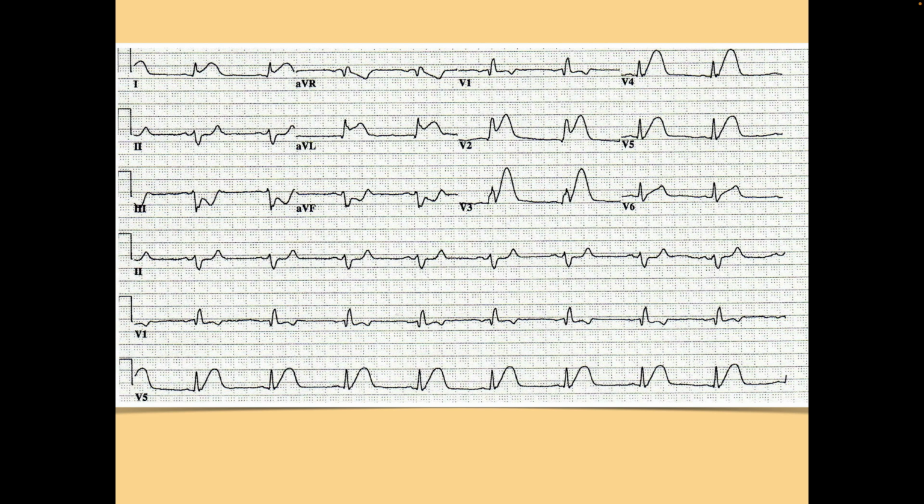And what about this one measured from the J point? Yeah, right on. So the ones that absolutely fit our definition of hyperacute T's are these, not quite these, and this one, if you measure from the J point, not so much.